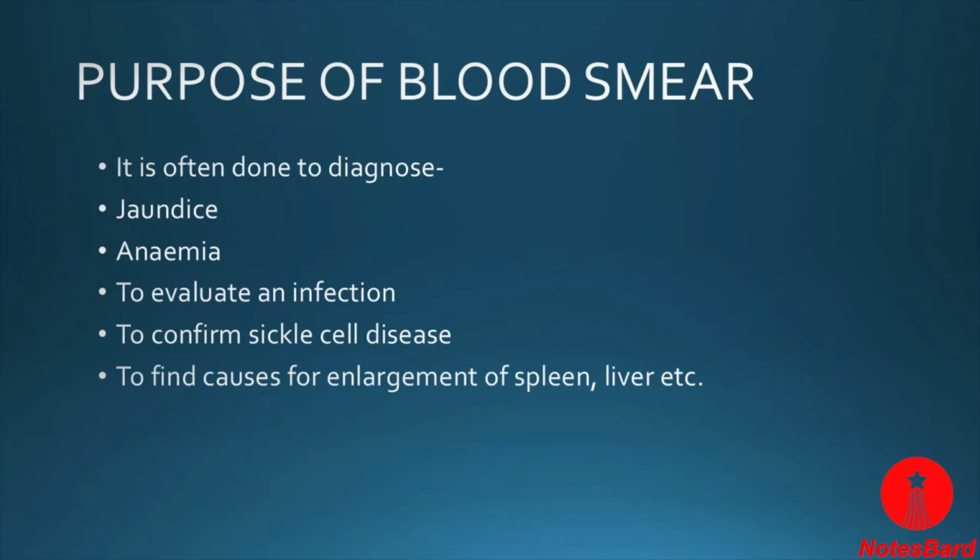Similarly, there are some other problems. It is also used to look for malaria by the count of platelets in our body, to confirm the symptoms of bone pain, and to look for the causes of bruising and excess bleeding, like hemophilia or many other diseases.